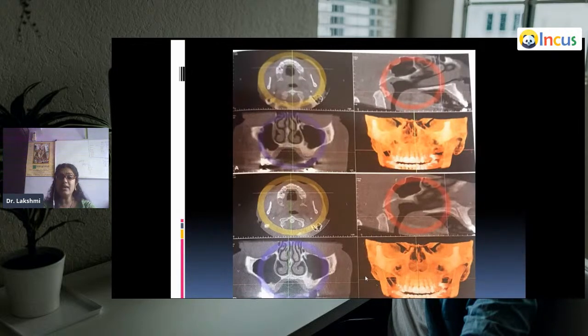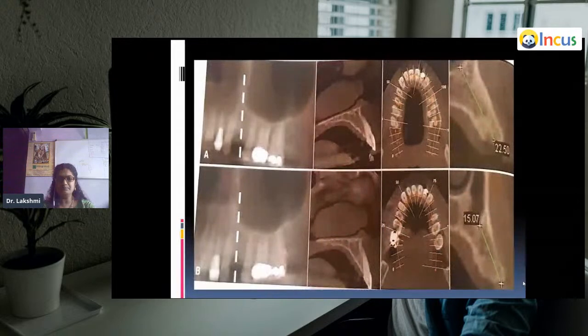It is reoriented. The circular rotational tool used over here, the colored circles, are superimposed on the images to be viewed, and then you get the resultant image like this. These are the reference planes which are drawn. This simply means that raw data is reoriented according to the region of interest. Fine. So this is the reorientation of the data.